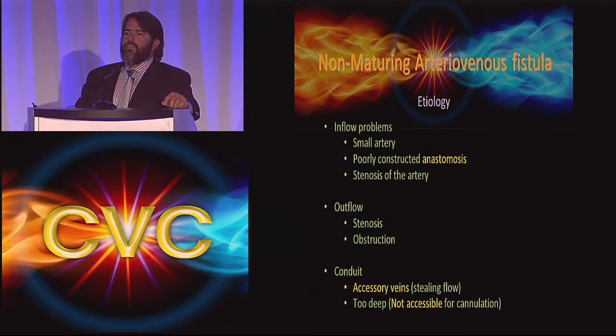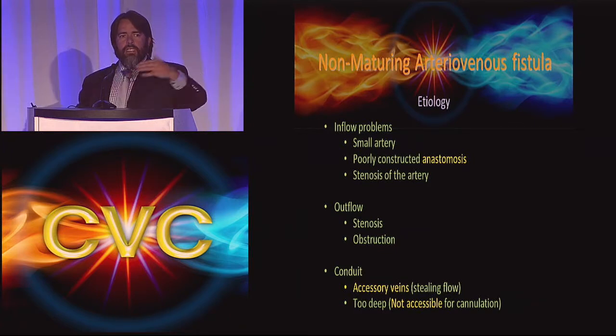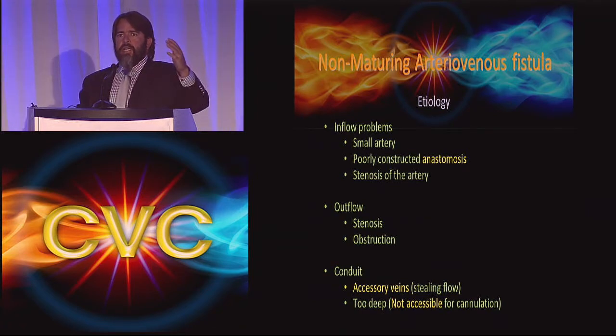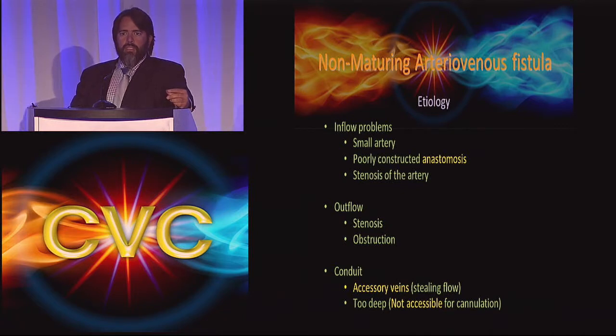And this is something that I just realized in my laboratory. I don't know who runs a laboratory within the group, but make sure that you speak to your techs in the lab that the vein needs to be visualized all the way through. Occasionally, they will give me a mapping that says 3 millimeters here at the antecubital fossa, 3 millimeters at the mid-cephalic, mid-forearm, and 2.8 millimeters at the distal forearm. But then they did not mention the fact that there was an area of stenosis of the vein where it was sclerosed.